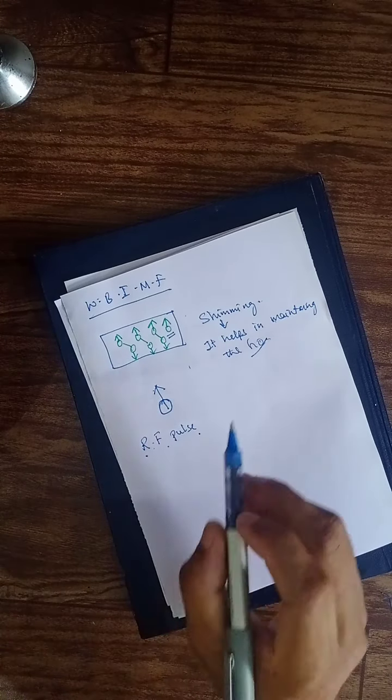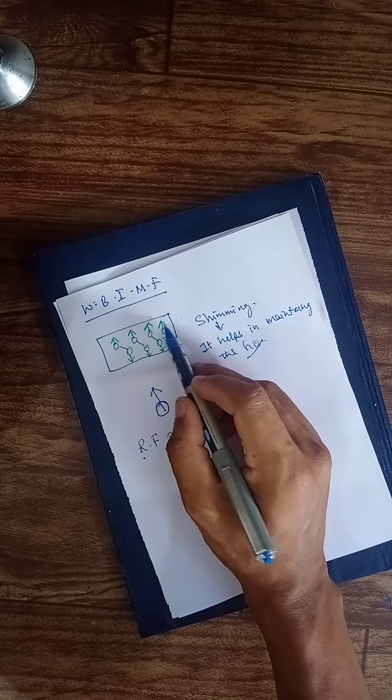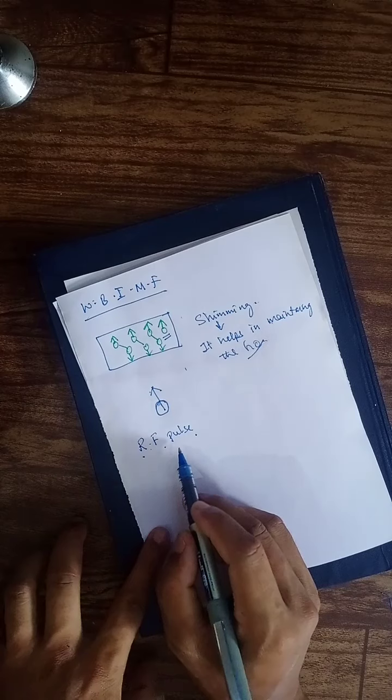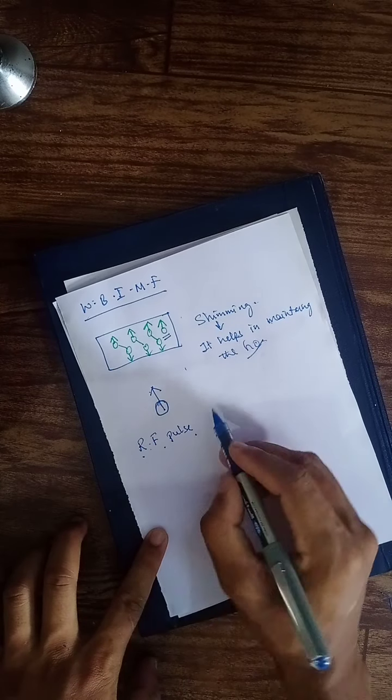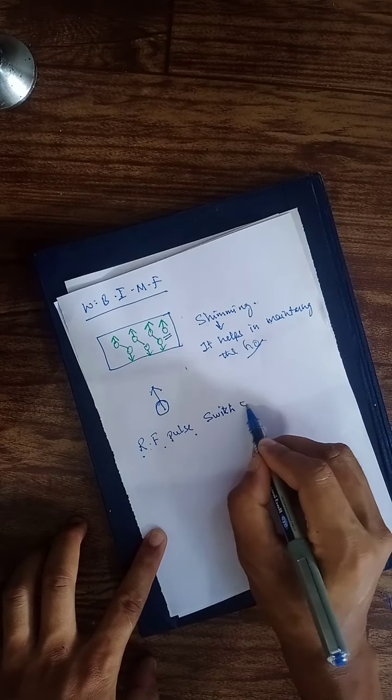Homo means same, right? That's why it's in the same direction. So let's go to the third step, RF pulse switch on.